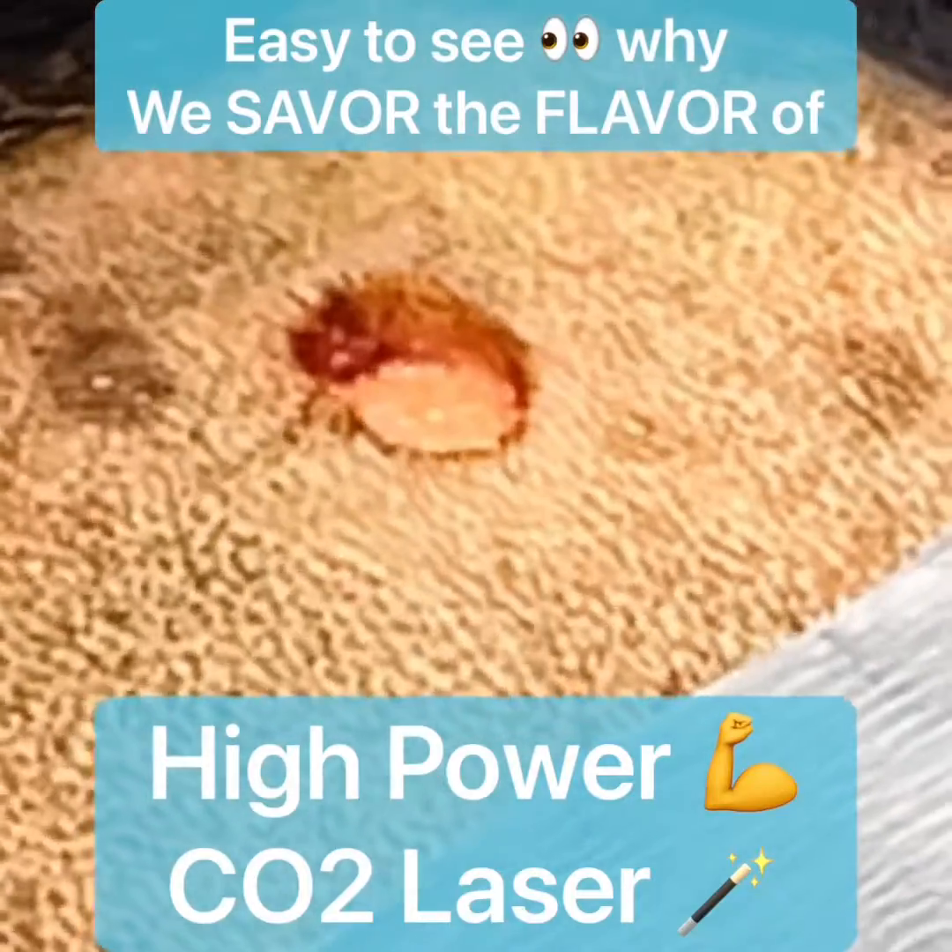Here you can see that the lump has been removed — there's no blood. Now we're going to put in one suture to close this.